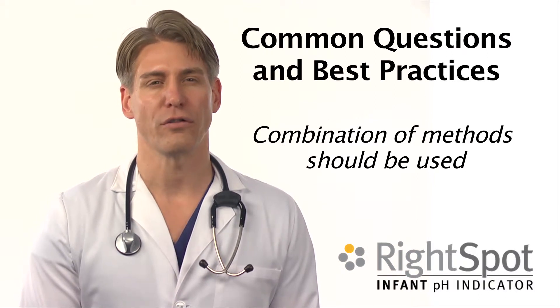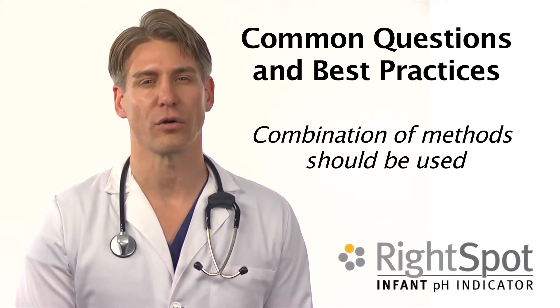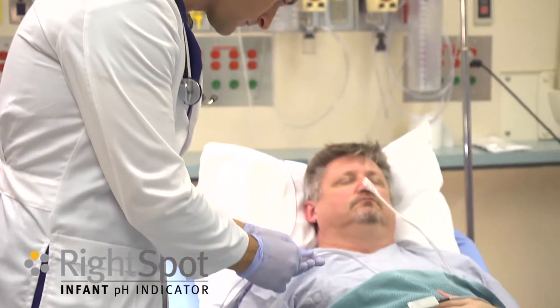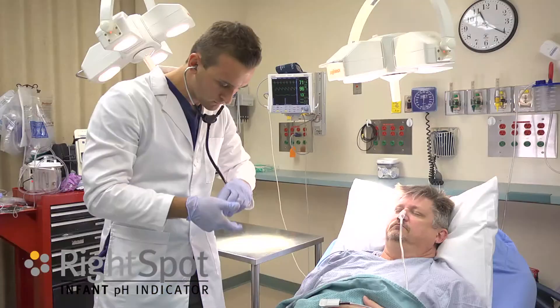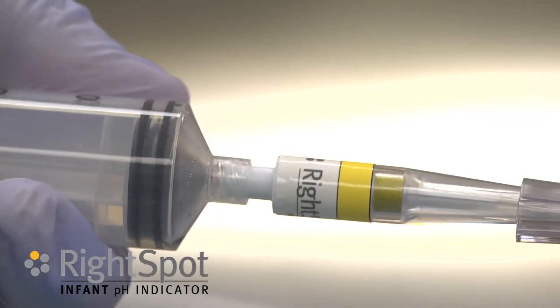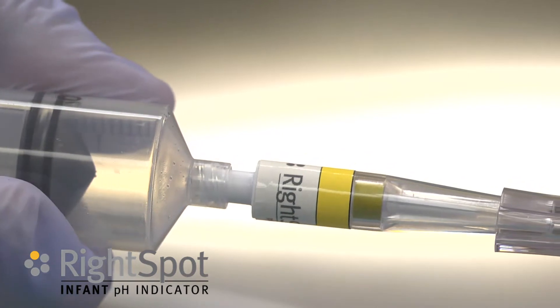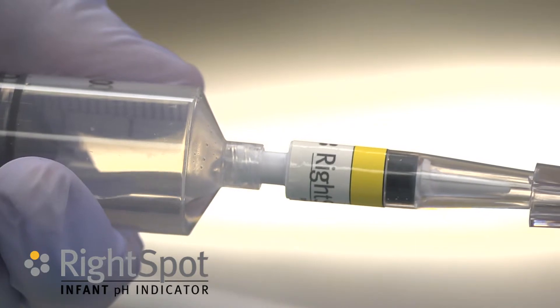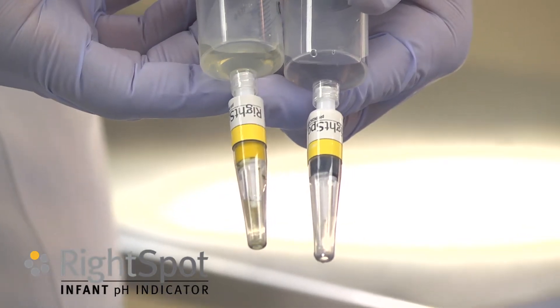According to the Emergency Nurses Association and the Association of Critical Care Nursing, one should obtain the distance of the tube for stomach placement, auscultation over the epigastrum, view the color of aspirate to see if it appears to be gastric, and verify with pH. One can use the Right Spot pH Indicator to verify with pH.